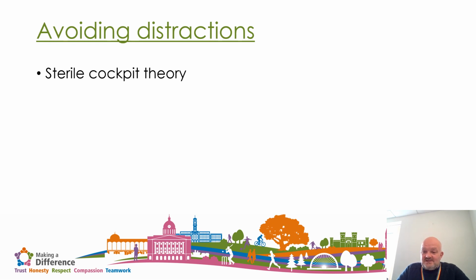You need to discuss with them the fact that yes, you'll answer their questions, but now you need to go into the kitchen, you need to shut the door so that you can set up the syringe driver, so you do not make any mistakes that may be detrimental to the patient. And then when you've done that and set that up, you will be happy to answer any questions, any worries or any concerns.